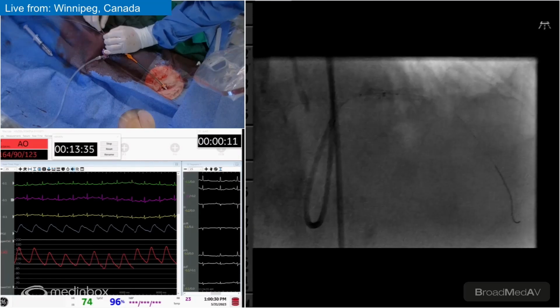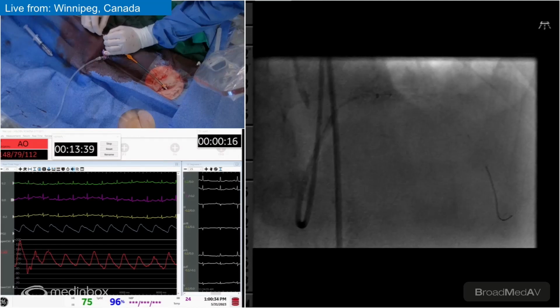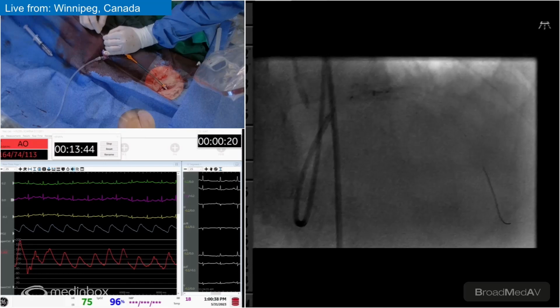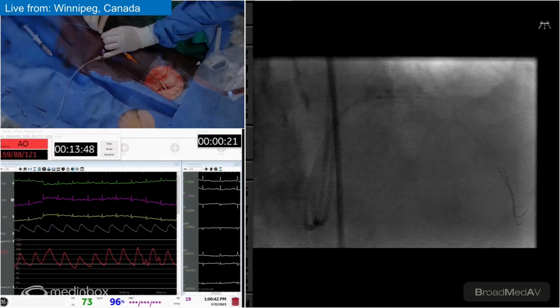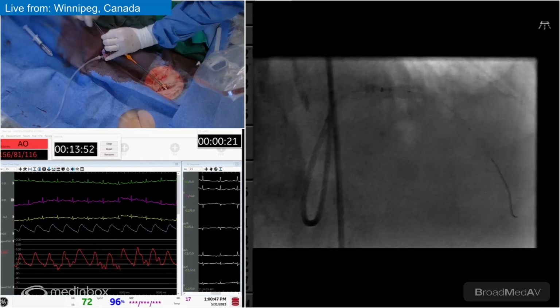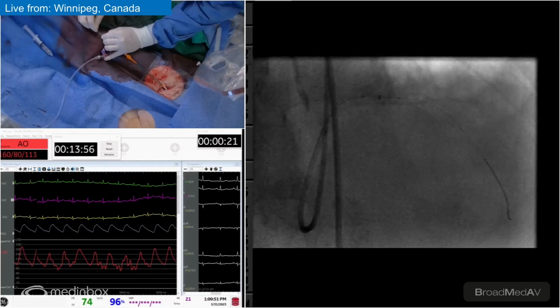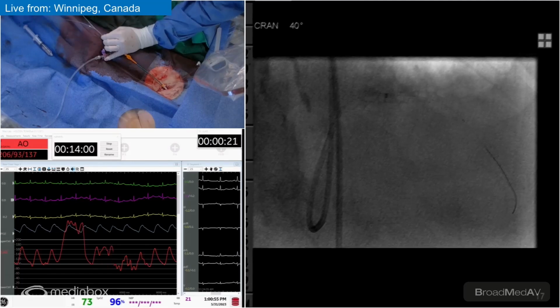Oh wow, that thing does not want to advance. Okay, you can come down. What I'm going to do is try to even get the balloon distal. Let's see if I can just track the guideliner through it. The advantage you have once you're in the stent is you could always switch over to a larger balloon. Let's do the OCT now. I think we have enough, at least from the proximal edge of the stent we're away. Let's try it one more time.